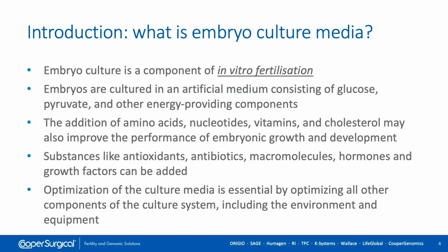Of course, it's a component of in vitro fertilization, IVF, and embryos are cultured in this artificial environment, which consists of substrates, including glucose, pyruvate, lactate, etc. The addition of other components such as amino acids, nucleotides, vitamins, etc. to hopefully enhance the performance and improve embryonic growth and development. Also things like antioxidants, antibiotics, macromolecules, proteins, etc. can be added, and optimization of the culture media is essential by optimizing all the other components of your culture system, including the environment and equipment used.